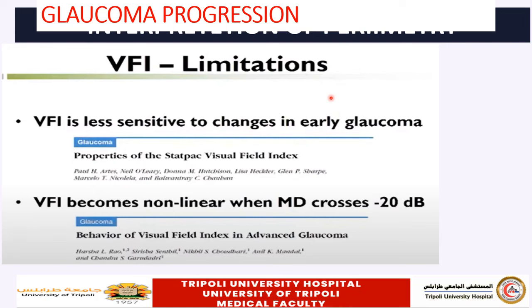not from other calculations. Another point, that the visual field index takes more weight for the central points as compared to the peripheral points. So it is more representative of the residual central vision of the patient than the periphery.